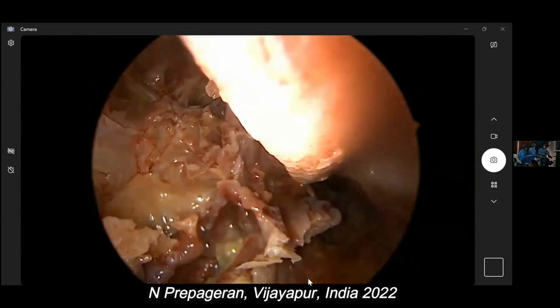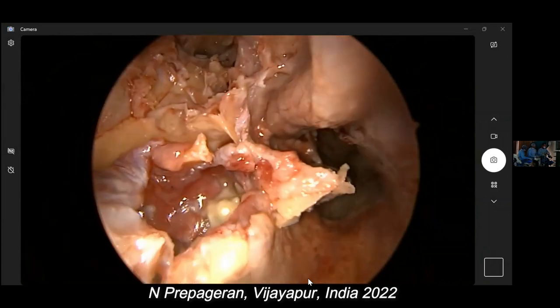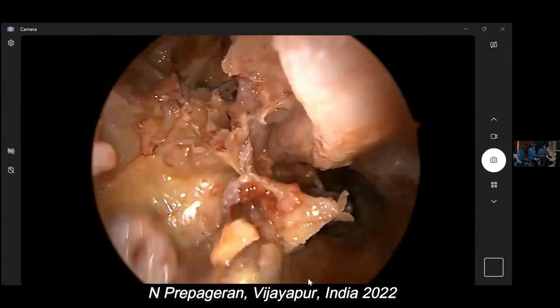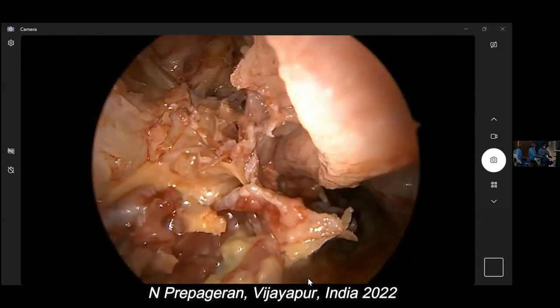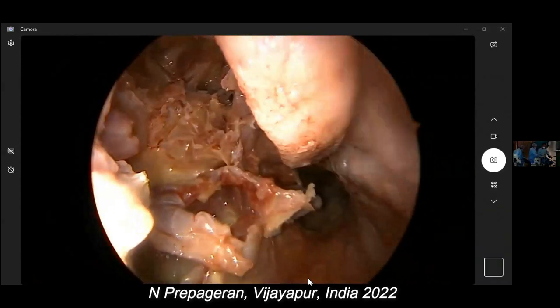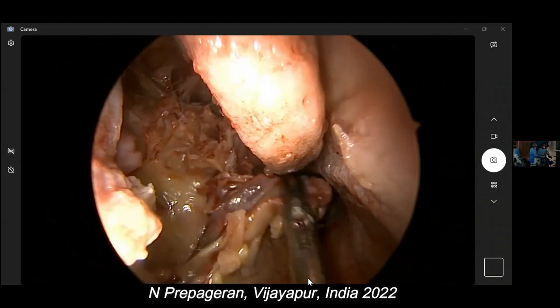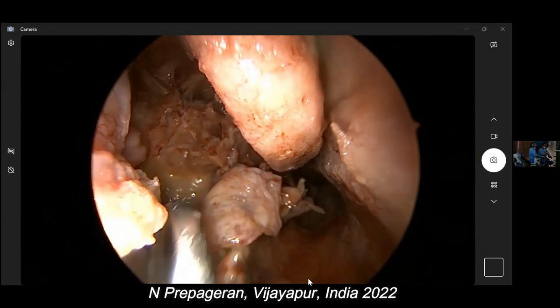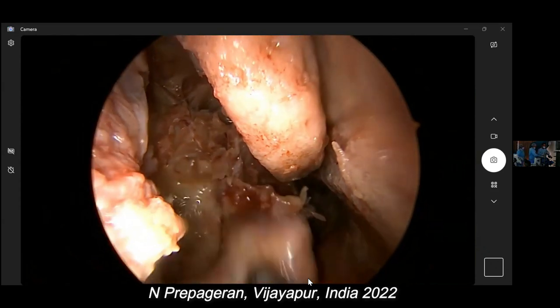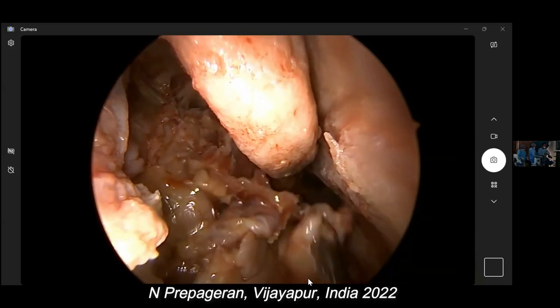That is your floor of the orbit that I removed just now. The mucosa is coming out. So you can see the posterior wall of the maxilla. Clear, right, guys? Can you see how thick the mucosa is? You've almost stripped off the maxillary mucosa. You won't get mucosa so thick in a fresh frozen cadaver. This is because it's soft embalming, no? Okay. Good.